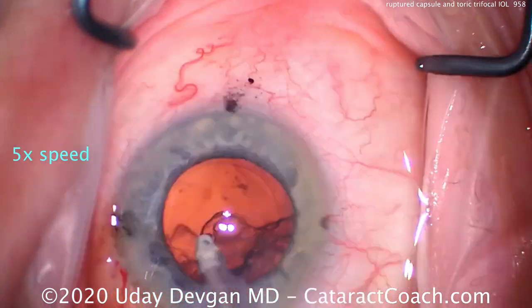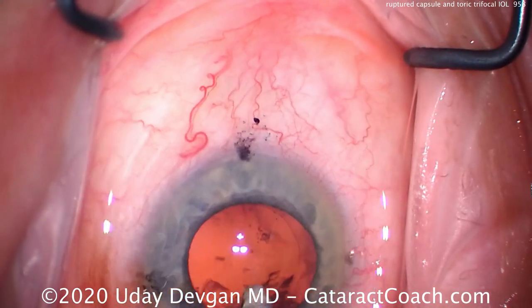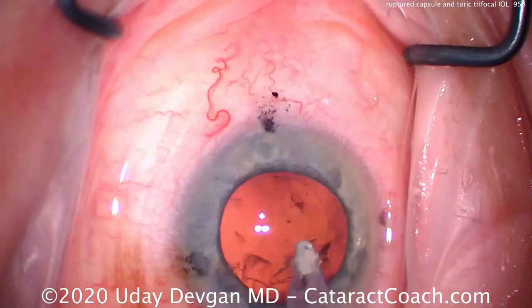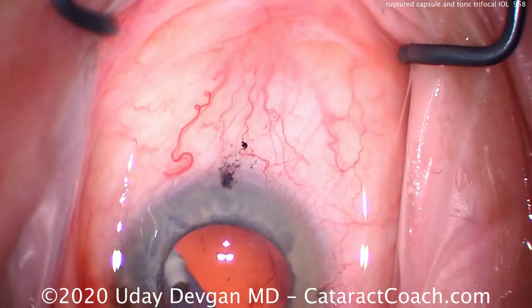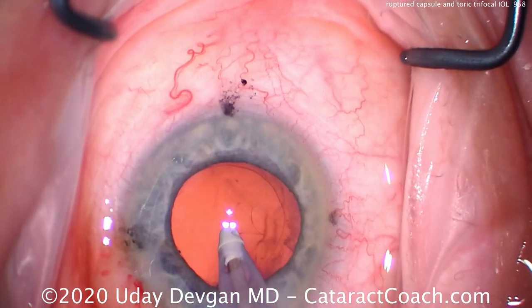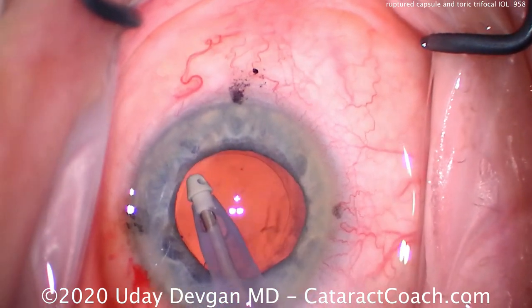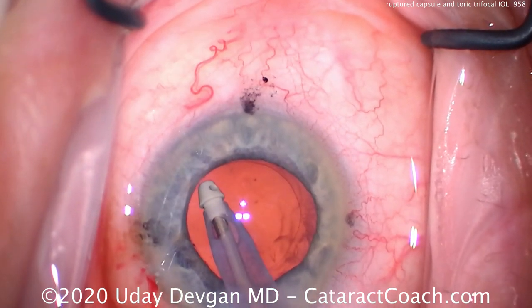Let's do the cortex removal. As we do the cortex removal it looks pretty smooth and we get out that epinuclear shell and most of the cortex. Now let's slow things down a bit — cleaning up the cortex and then we're going to clean off that posterior capsule. Remember, the posterior capsule is just four microns thick. We try to clean off that little bit of debris and right there — we just made a hole in the capsule.